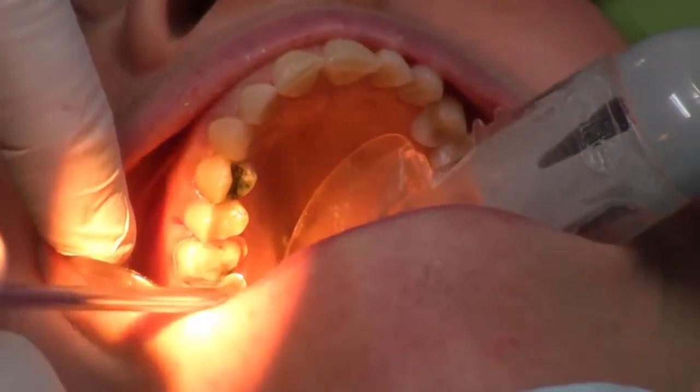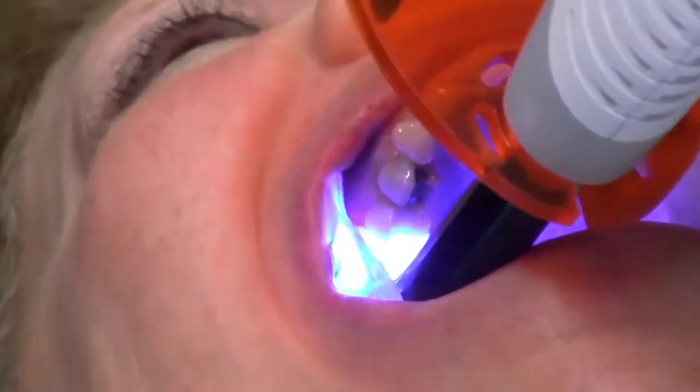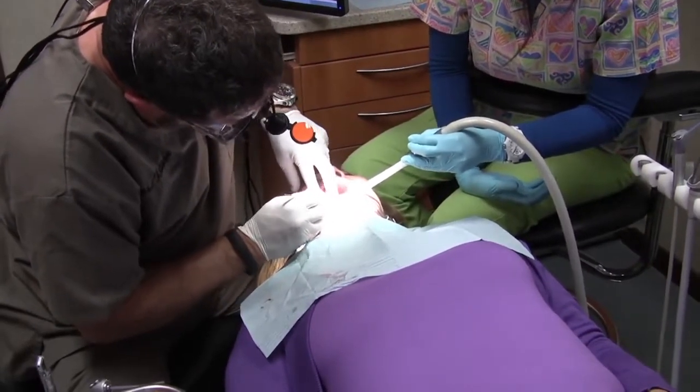Then the internal portion of the crown is prepared so that the porcelain can be bonded to the tooth. The tooth is then treated with bonding material and placed in the mouth with a composite cement. And about two hours later, just like that, we have a CEREC crown.